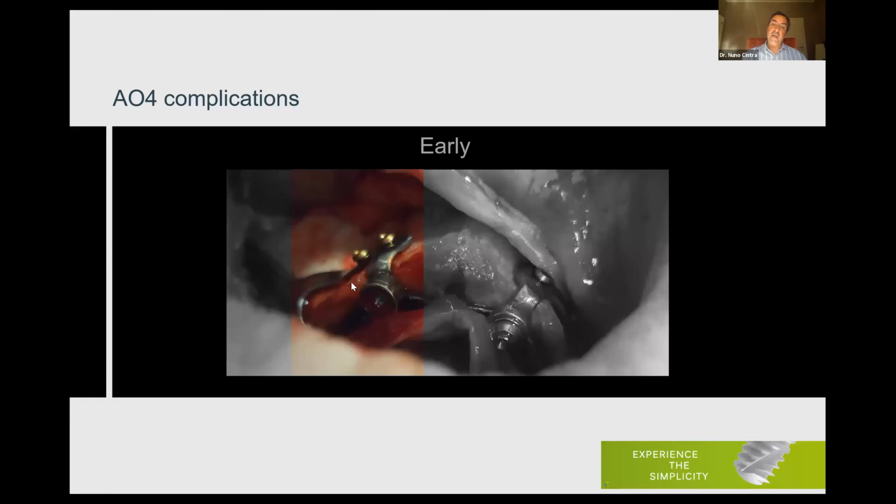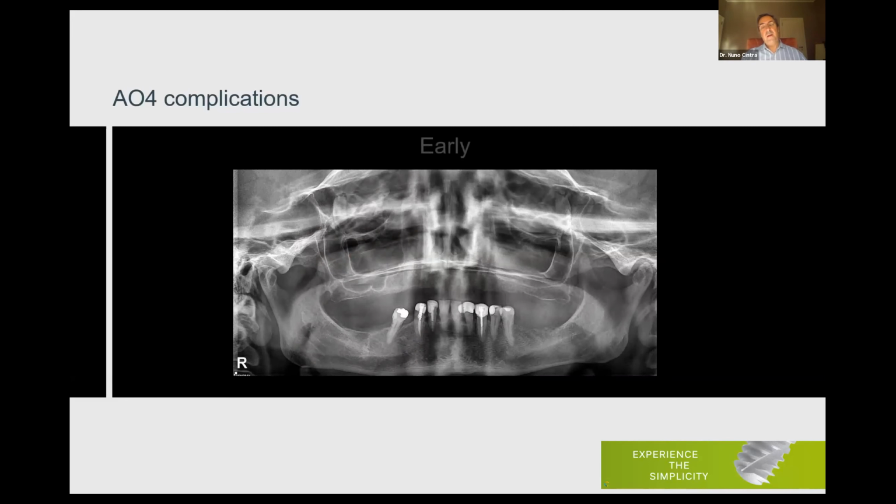Because the measurements or the 3D readings from the CT scan sometimes can be inaccurate. And if they are not right, when we place the implant, when we sit the implant on bone, sometimes we have these gaps. And these gaps can be a problem because these implants can break. If the titanium bar can break, imagine a thin structure like this one. Of course, it can break, and I will show you that it breaks.